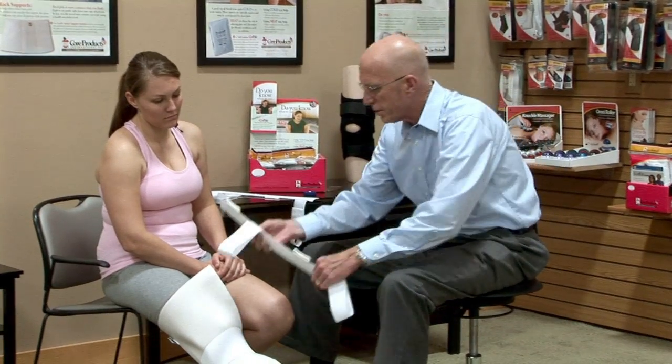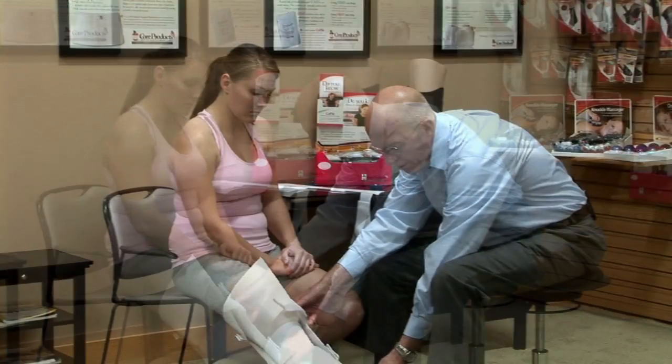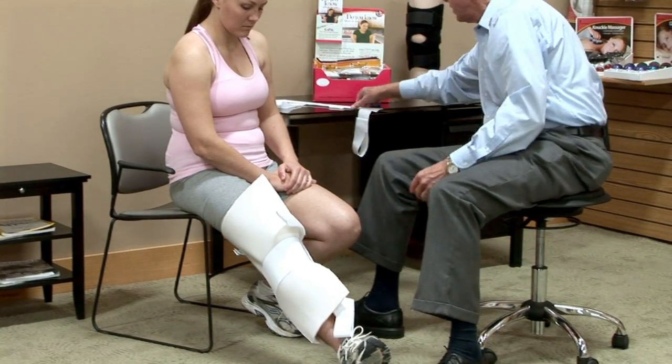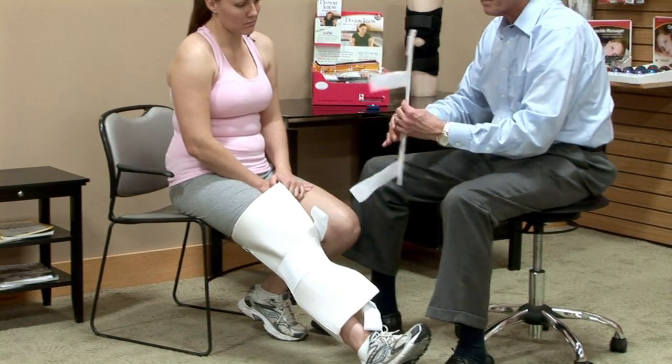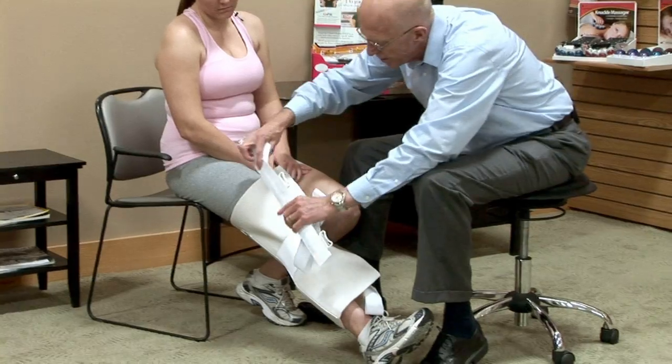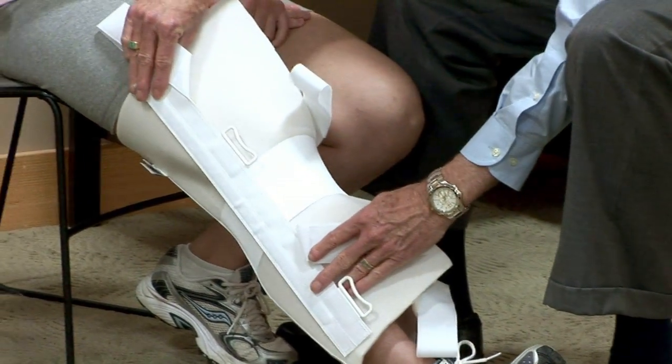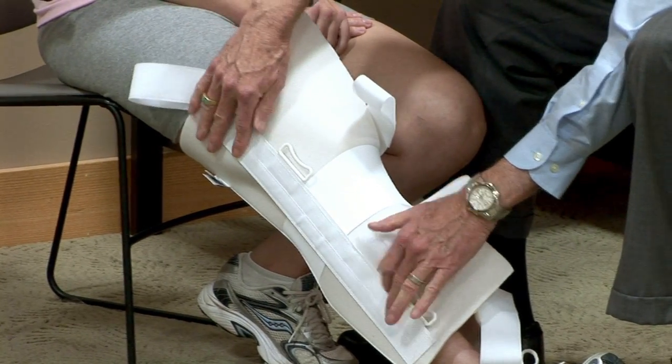These simply attach with Velcro. I'm going to make sure that it's to the very outside and very inside, like so, and do the same thing here. If it's to the front or towards the back, it can't support the knee. We want this to the very lateral and very medial.